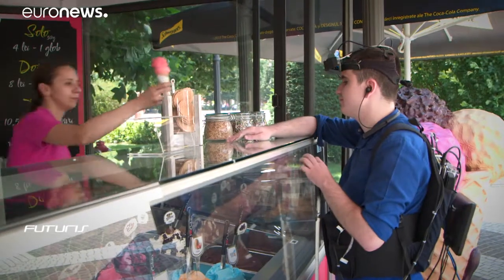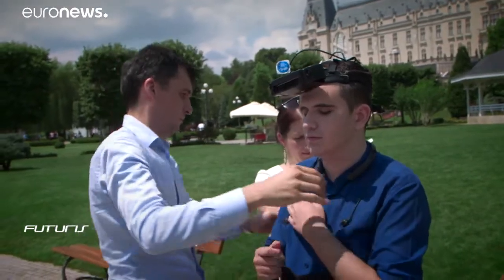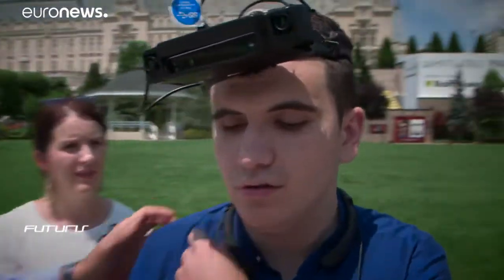Regarding outdoor use, we are relying on stereo cameras, two cameras that see the environment at the same time, and based on these two images, we estimate distance to the objects such that we can compute 3D information from the environment. You need to understand that this is a life-critical application, so the system cannot fail, signaling a dangerous situation like a hole in the ground, for example.